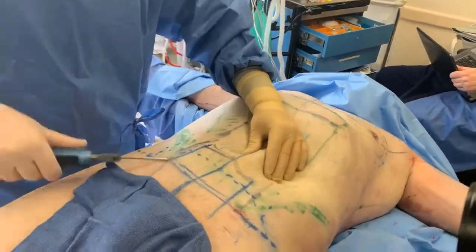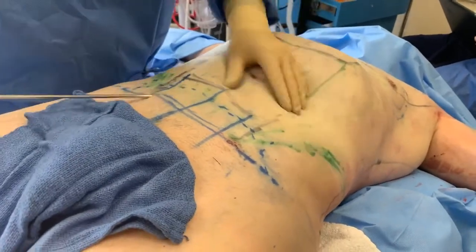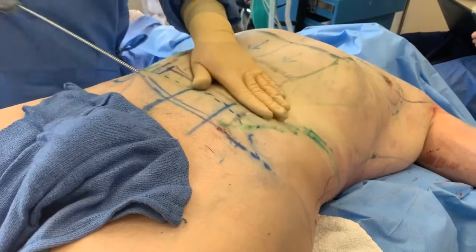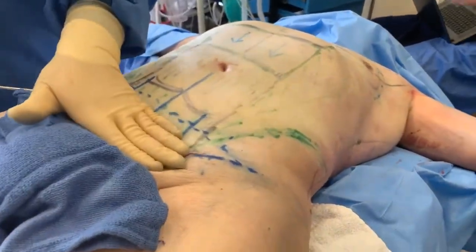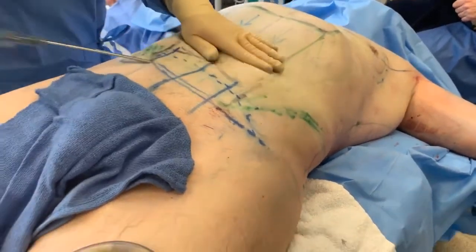Because remember, he has very loose skin. We're going to also do internal heating, but also remove the skin. We're going to tighten it by removing the lower part of his skin as well.